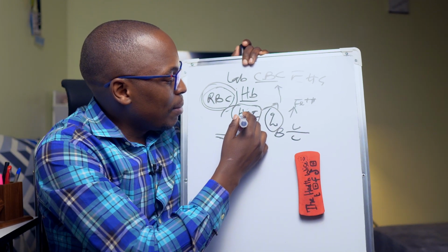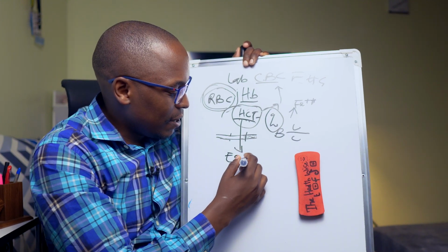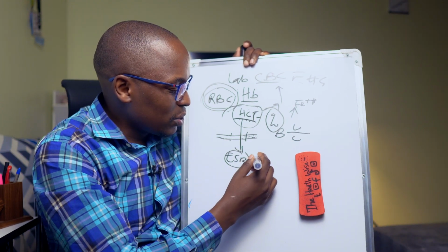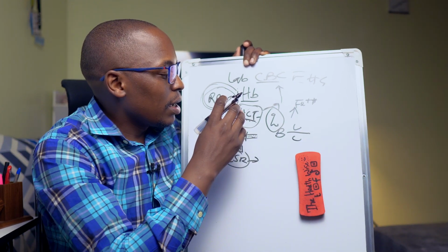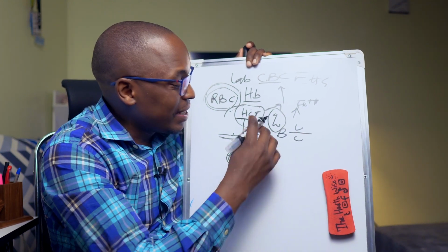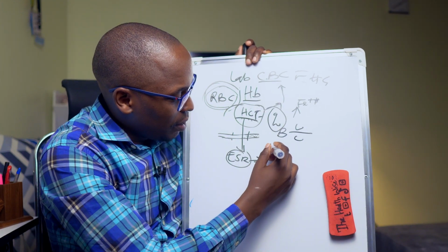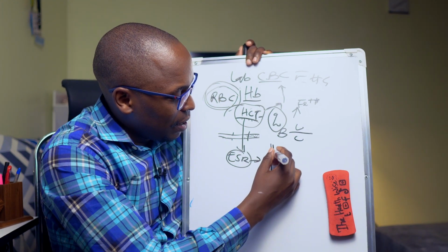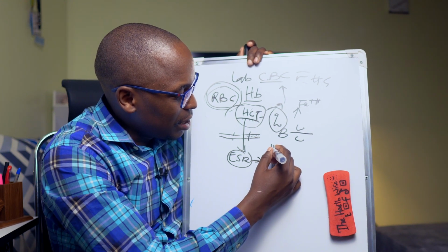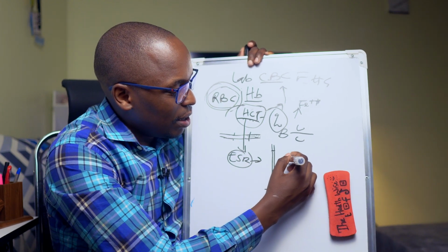Now, while still talking about HCT, there's another test that we call ESR. This is almost similar, but with this one you don't use the centrifuge. You're using gravity. This is not included in the full hemogram report. Blood is put in a tube like this one, up to maybe this point here, and then it's given 1 hour.